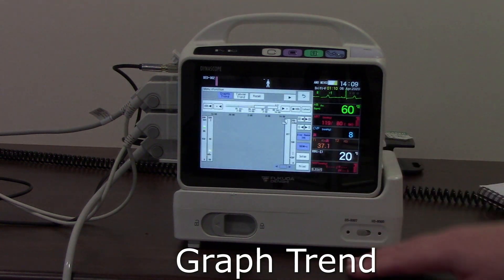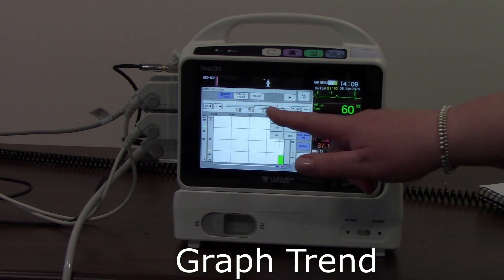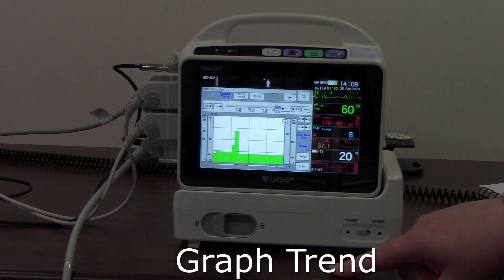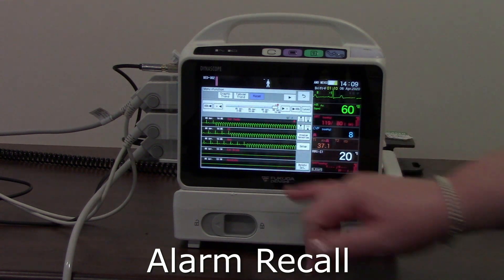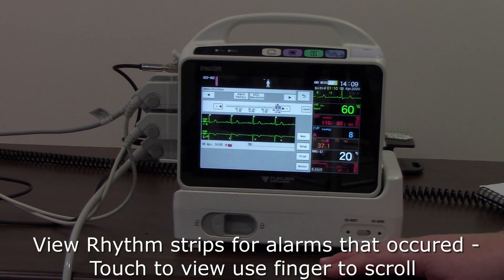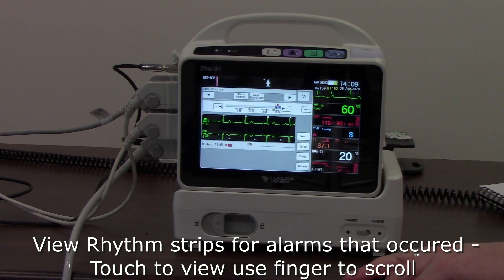I can also go into my graph trend from here and change time intervals if I want to. From there I can also go into my alarm recall, which shows any alarms that have occurred. If I touch the one I'm interested in, it will bring it up in a larger size on screen and allow me to scroll backwards and forwards to view it more closely.